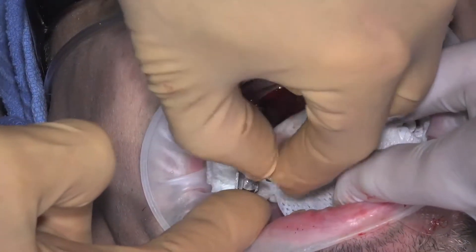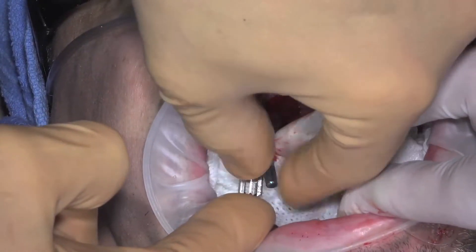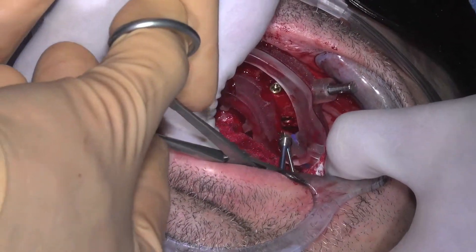Tip and turn it into the implant until you feel the engagement of the hexes, then hold the multi-unit abutment in place and tighten the abutment screw. Some clinicians find it helpful, when possible, to use a hemostat to deliver the multi-unit abutment into the implant.